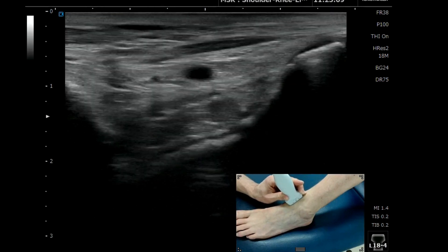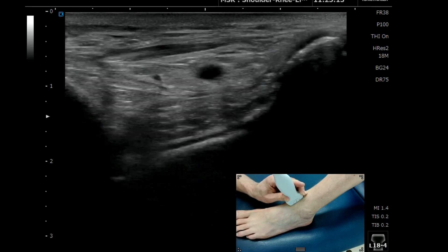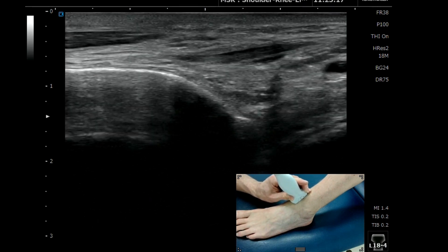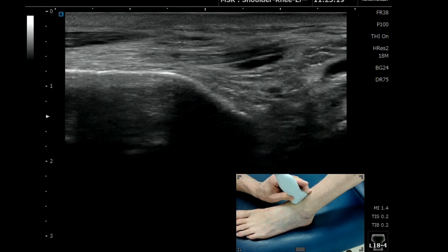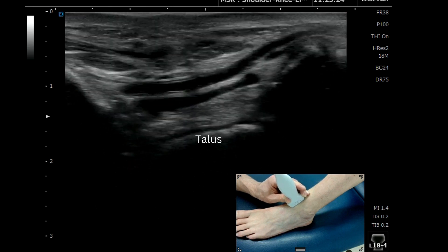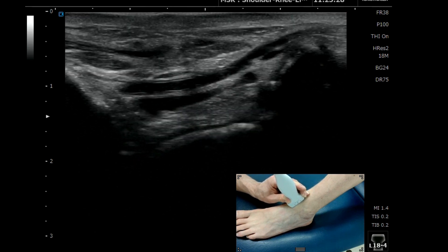This is a tutorial video looking at how to find the talonavicular joint on ultrasound. We can see the distal aspect of the tibia — bright hyperechoic bone — coming down and articulating with the talus. We can see that dark line of anechoic appearance of the articular cartilage of the talus.